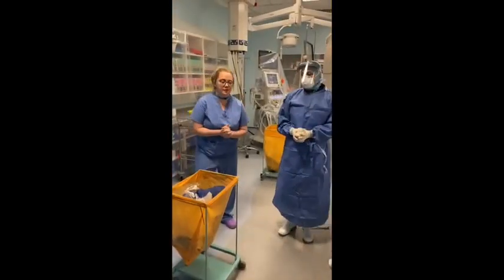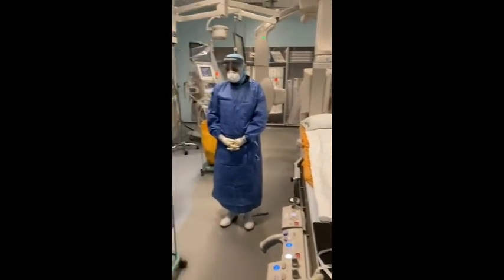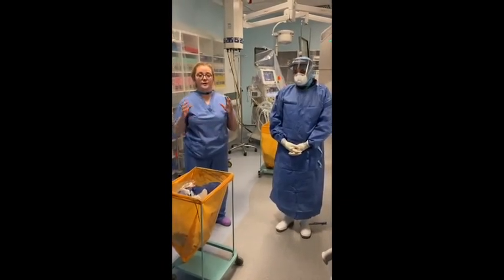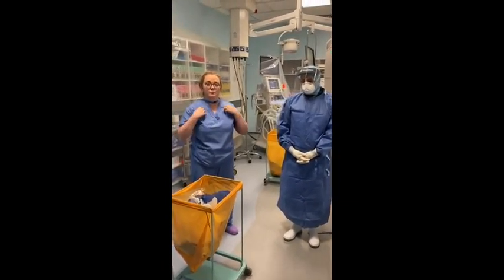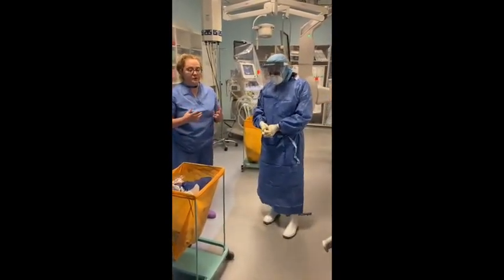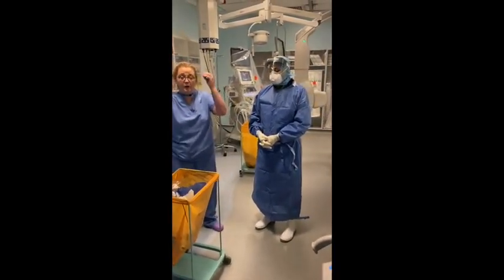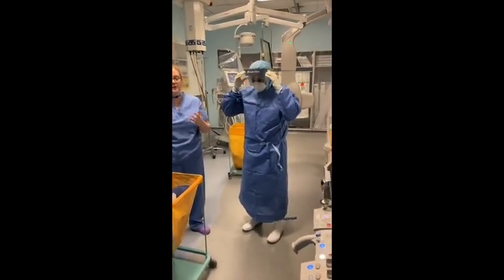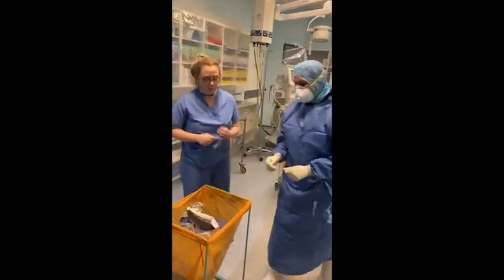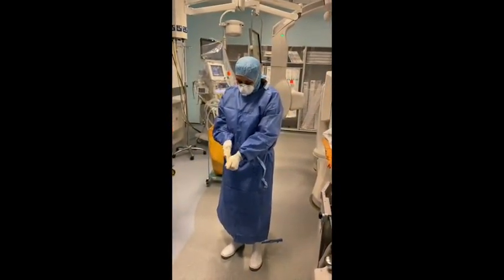At this stage, we are now assuming that we've finished the procedure, the patient has safely started to make their way to ITU or wherever they're ending up. At this point, every member of the team can then begin to take off their dirty equipment. For anyone who's an operator, if there happens to be blood on your visor, you take that off first, because obviously you don't want to touch that with anything that might be clean. So the visor will come off first, that will be placed in the bin. Then your sterile gloves will come off, because they will have blood on them from the procedure.